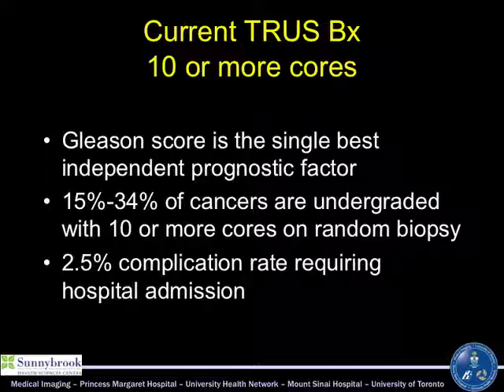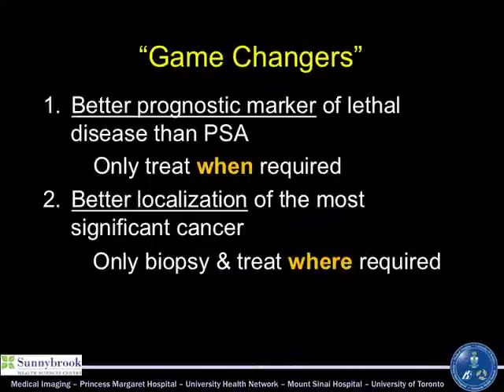And this is something that we certainly see referrals for MR coming in more and more. Many of them are physicians, people who work in hospitals, who've had bad episodes of urosepsis and don't want to undergo another biopsy without targeting or without an absolute need.